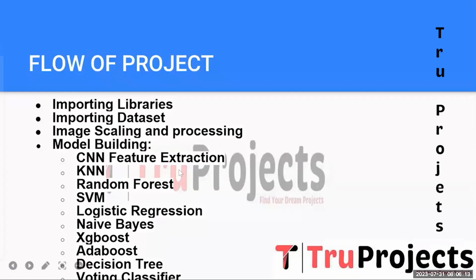And the third one is random forest. Random forest is an ensemble learning method that constructs multiple decision trees during the training process. Each decision tree is built on a randomly selected subset of data, and the final classification is determined by aggregating the predictions of all individual trees. By utilizing random forest in the project, the model aims to exploit the diversity of decision trees to achieve higher accuracy and robustness in diabetic retinopathy classification.